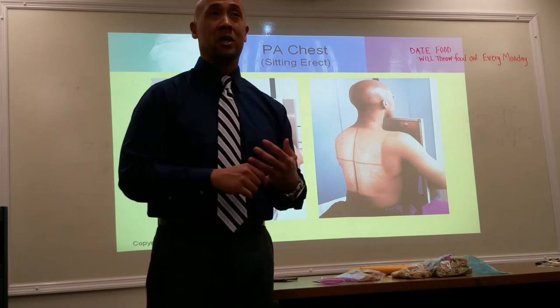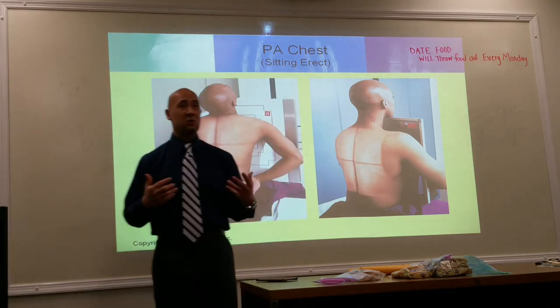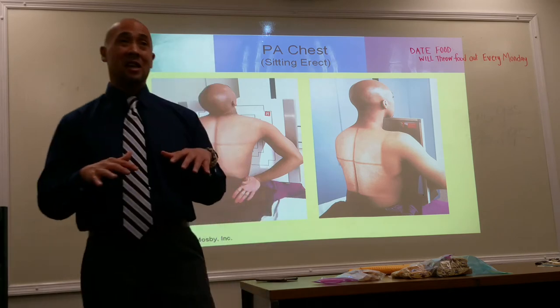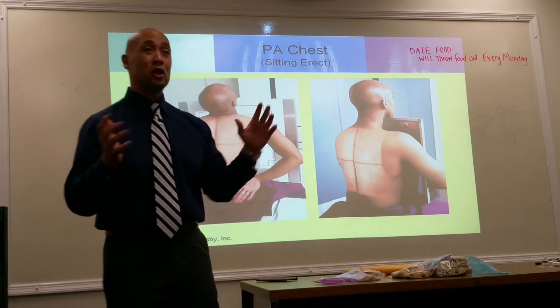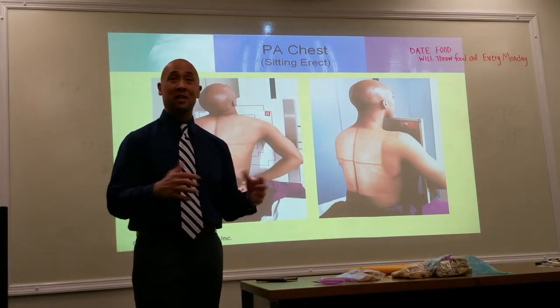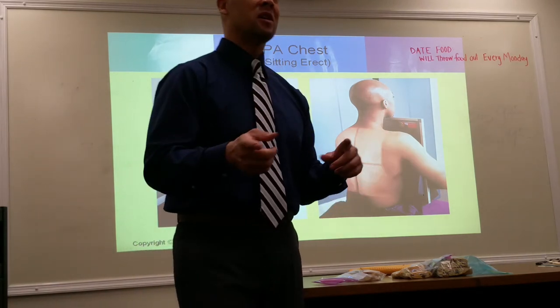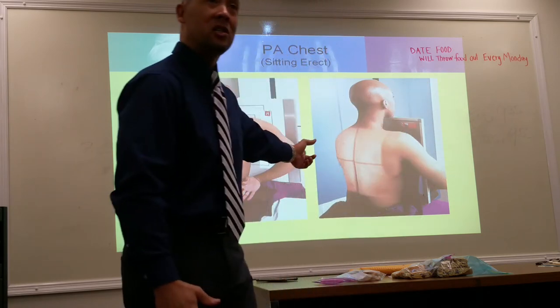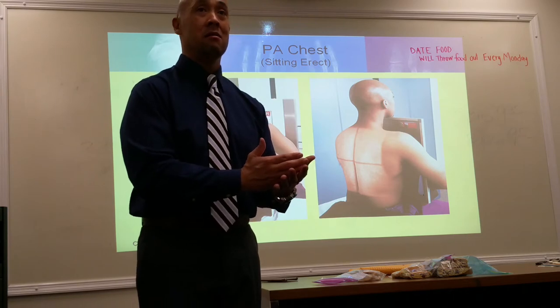What are we trying to accomplish there? What's the whole purpose of the grid, first of all? It's to remove scattered radiation so you get a more black and white image. Well, we kind of want long scale for a chest. So you'll have techs doing a chest x-ray without a grid because they're trying to accomplish that longer scale. But in doing so, keep track of your techniques that they give you for a gridded procedure and one without a grid, okay? So it'll be lower on that one, right?